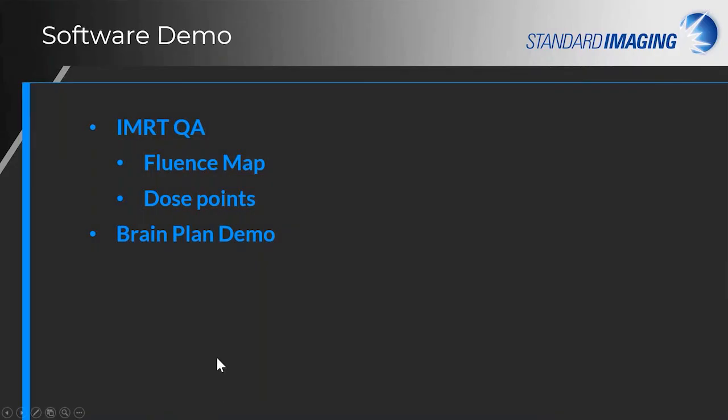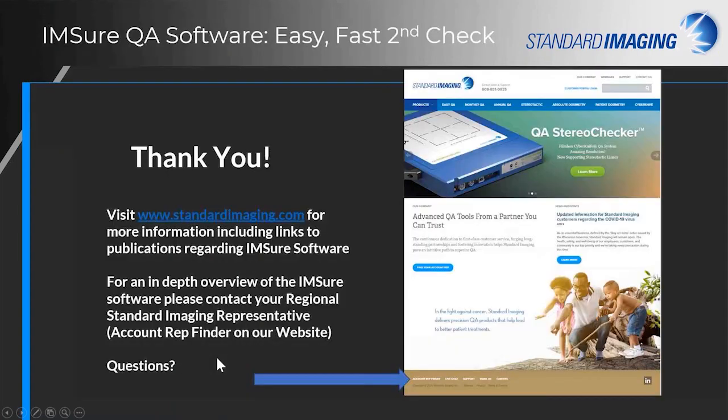And so now back to the PowerPoint. And so that concludes my presentation. I hope you've seen that IMSure is an easy, fast second check for multiple different QA requirements at a clinic. And I thank you for your time.